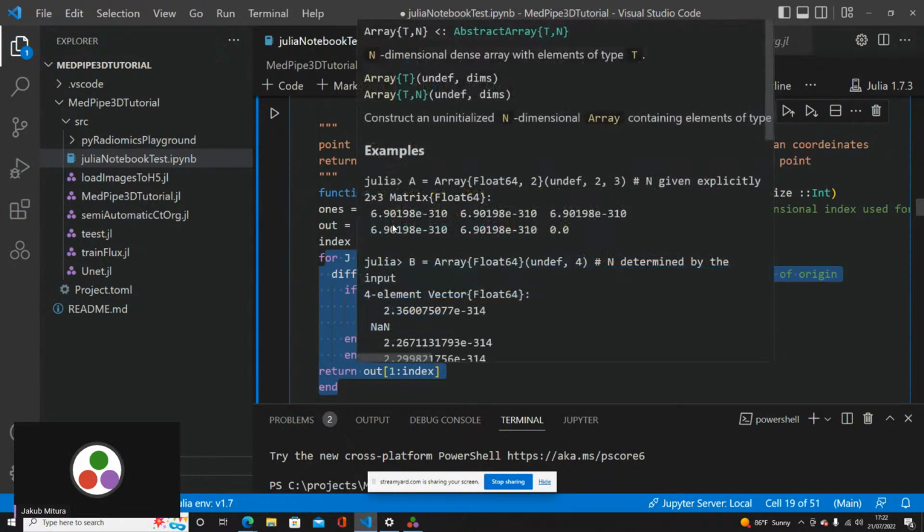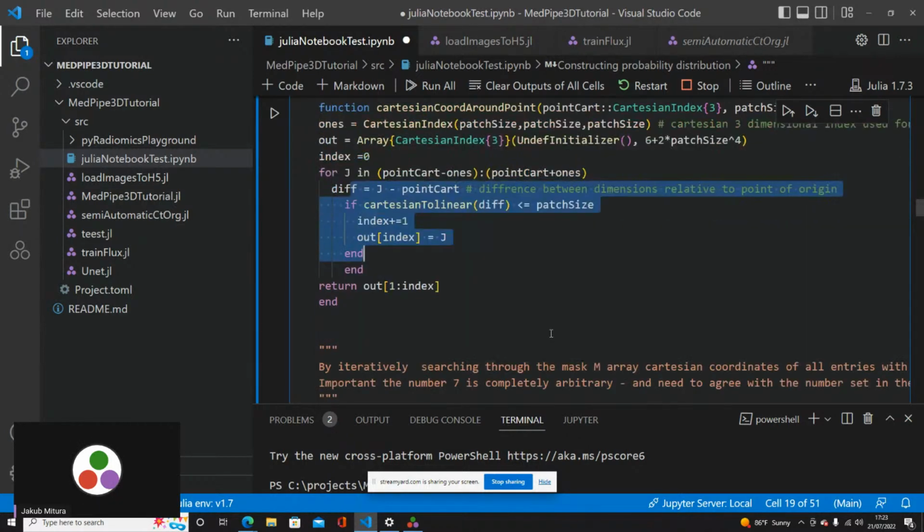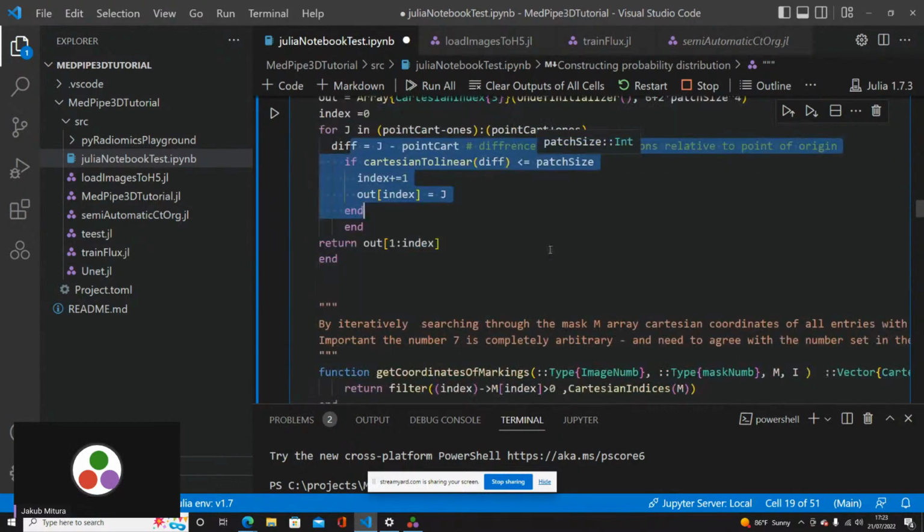So we get the Cartesian indexes of the area around the point, and we filter only those that are within the distance that we specified. This distance is a hyperparameter, which we defined at the very beginning, but it can be different. You can look farther away or closer. It depends on you; you can play with it if you prefer.